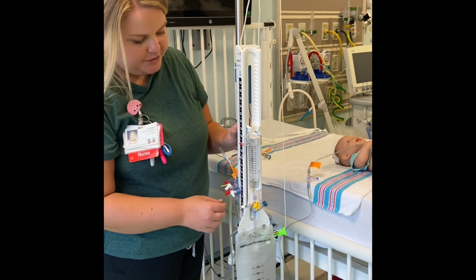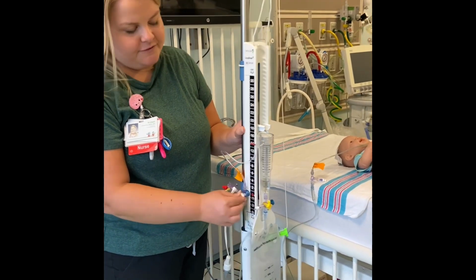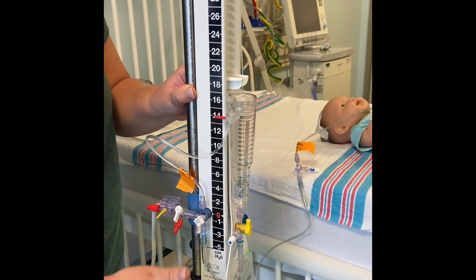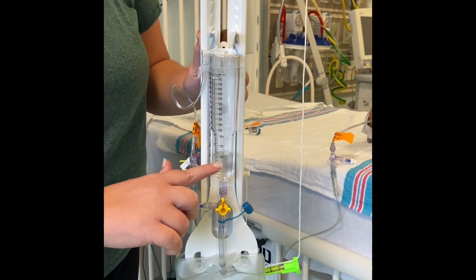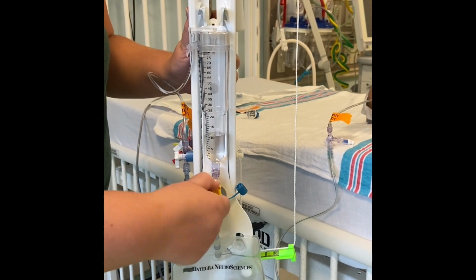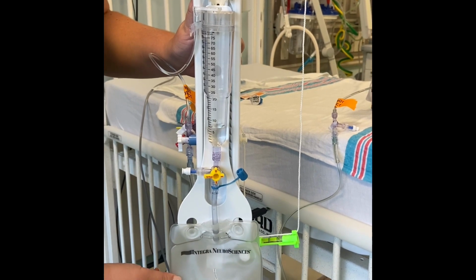The way that you're going to do this, first, take your stopcock over here, turn it off to your patient, so that way they're clamped here so that you're not pulling CSF. You're then going to remember that you have the 11, write it down on a sheet of paper or your whiteboard. Take the yellow stopcock, turn it off to the side, and let the fluid drain into the bag.